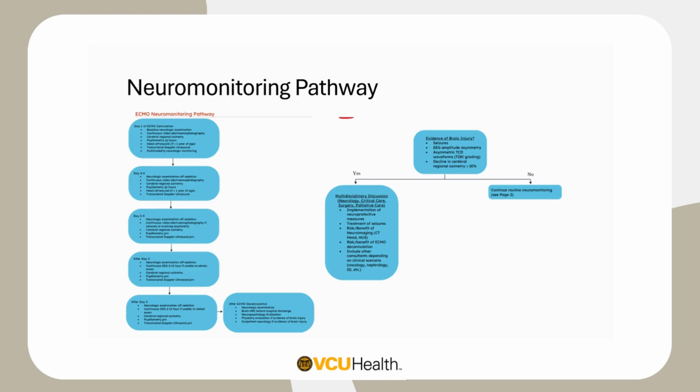What we do is we start that discussion the moment there's a biomarker telling us that there's a brain injury. So we are ahead of the game. We can't save every patient who has a brain injury on ECMO, but if we can catch the handful a year that you might, by altering your neuroprotection or decannulating at the right time and leading to another intervention, you're able to catch those situations. So that's what we've done.